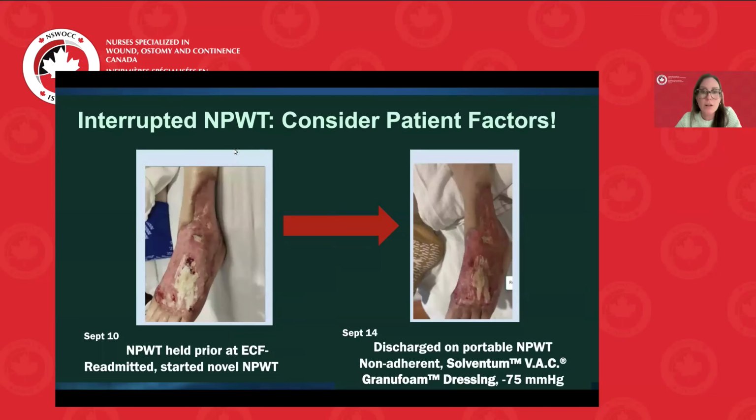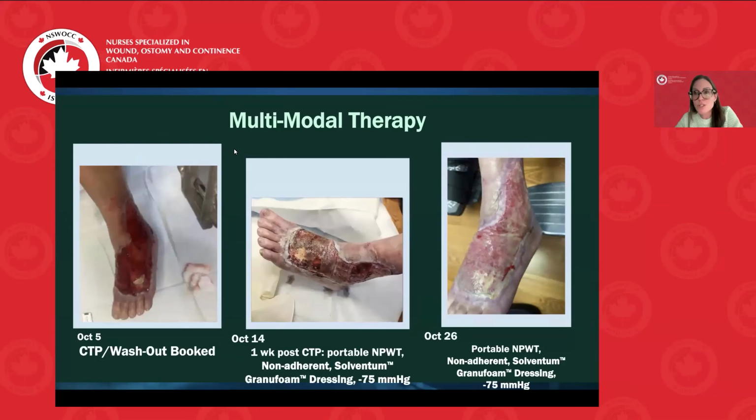But with that, we started to joke with this poor woman because she was in and out of the hospital with PE and all kinds of other issues. When she would come to the hospital, we would use the Peel and Place, and then she discharged, and she did tolerate that ActiV.A.C. with the decreased setting, which we modified. But we actually started to joke that she was essentially trying to get readmitted because she really loved the Peel and Place. She really tied into that dressing and felt like she was doing something really good. It didn't hurt. She actually did really well with it.